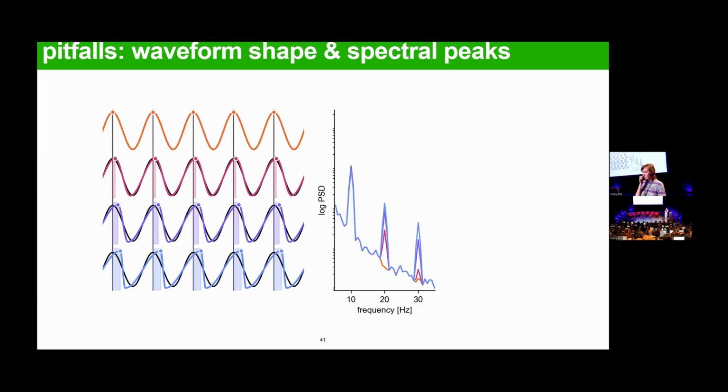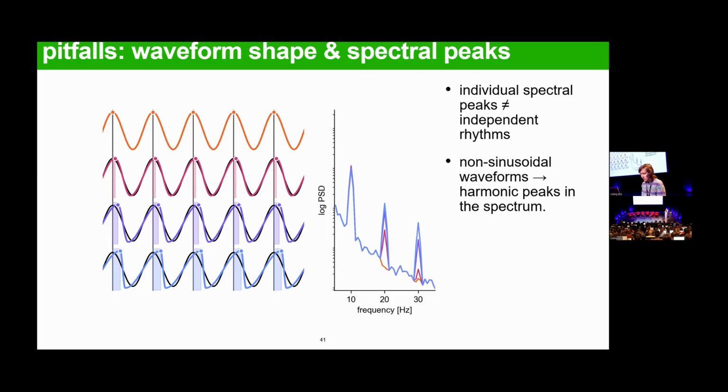So I think we had the question in the tutorial, why do we have line noise at 50 Hertz, 100 Hertz, 150 Hertz? It's a similar thing. I just want to say that while these entities look nicely distinct, so there's an alpha peak and there's a very visually distinct beta peak, it may actually come back to the same neurophysiological entity. All right, so many things you have to keep in mind.